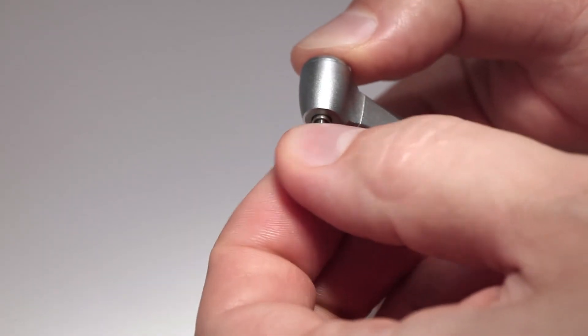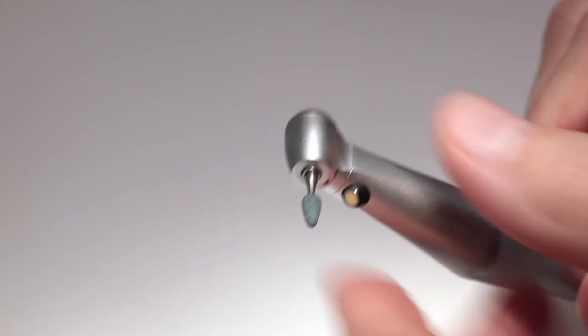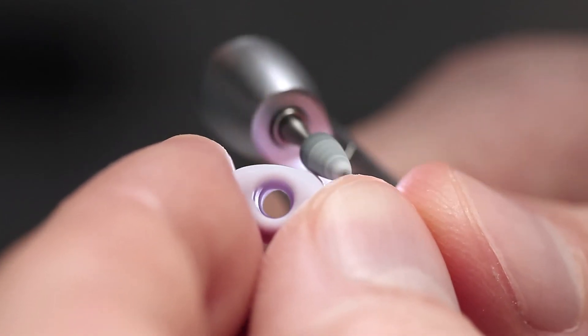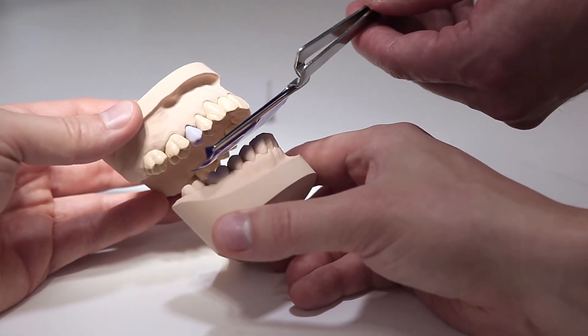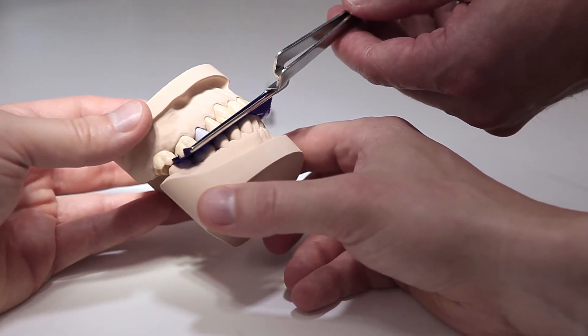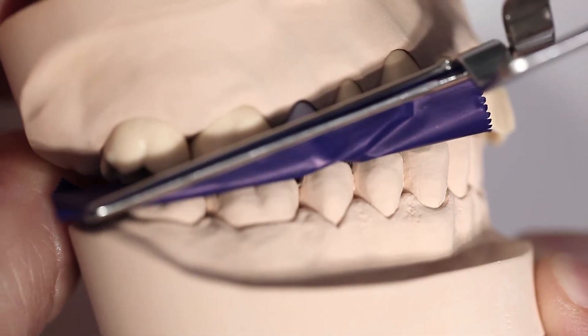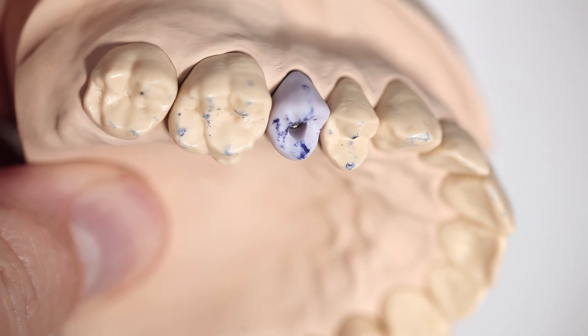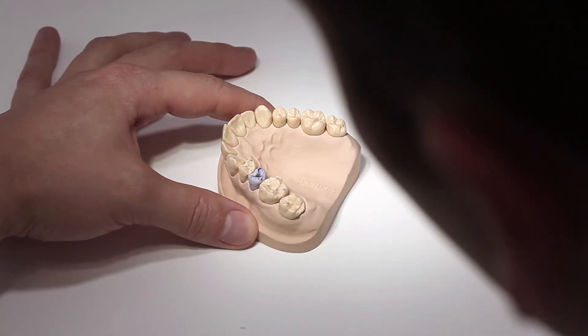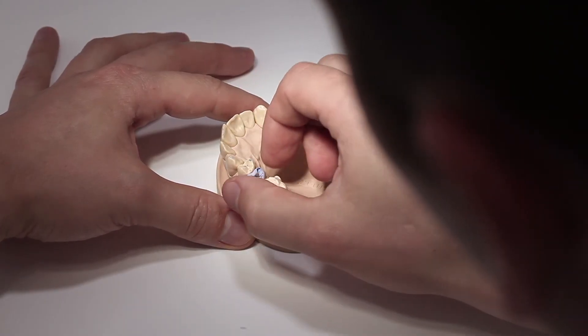If adjustments are necessary, unscrew the implant screw and remove the hybrid abutment crown. Amendments by grinding should be done extra-orally. Now check the occlusion and articulation, and make adjustments using suitable grinding instruments as necessary. Once the clinical try-in is completed, take out the implant screw and remove the hybrid abutment crown.